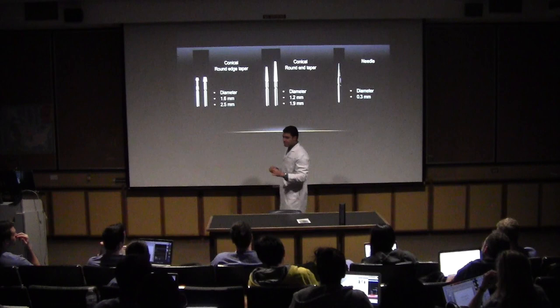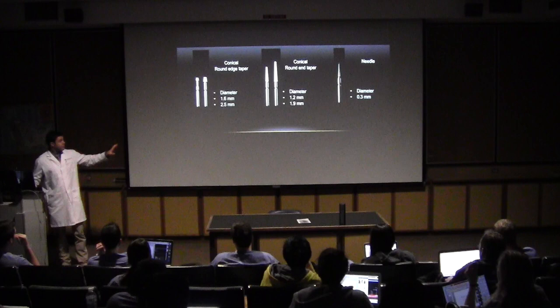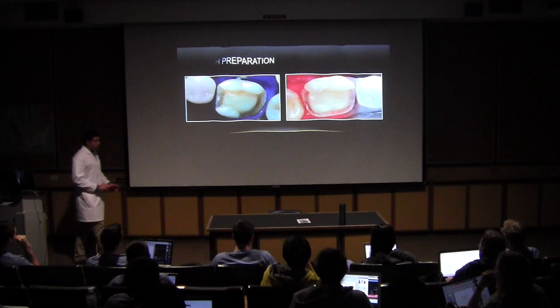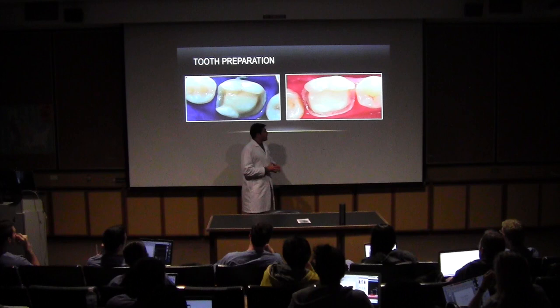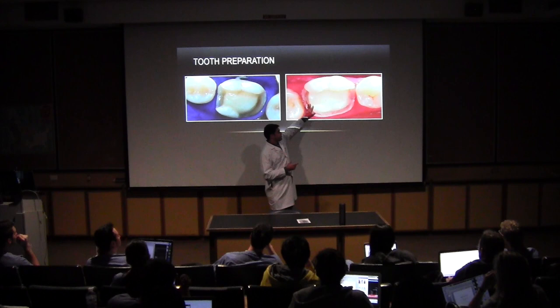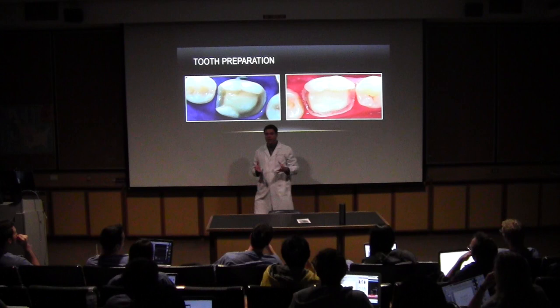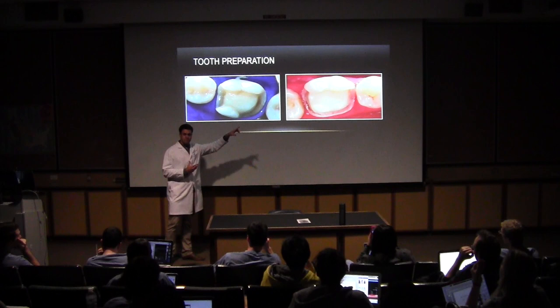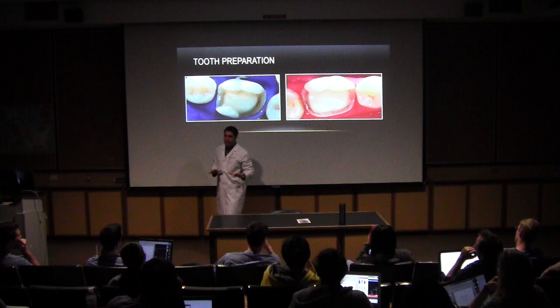So let's start now with the prep, step by step, using just these 5 diamond points. In all the preps that we do, we want to have this enamel margin here. This is the perfect prep. We want supragingival margins, and we desire that we can see the enamel along all the margin, along all the shoulder. All right? Like this. If you have a prep like the one we see in this picture, perfect.